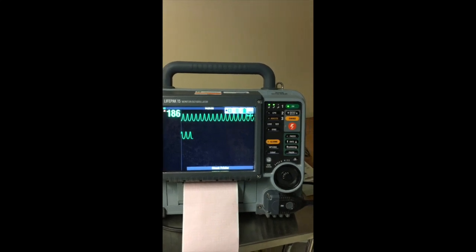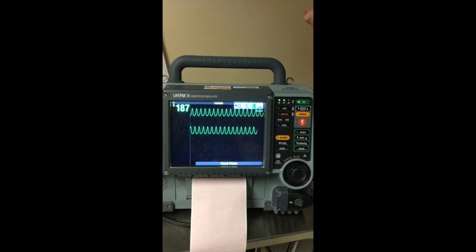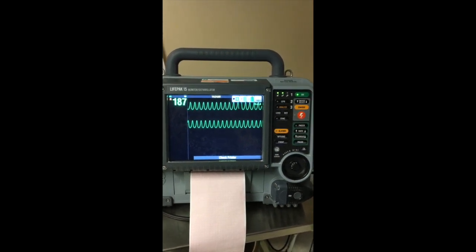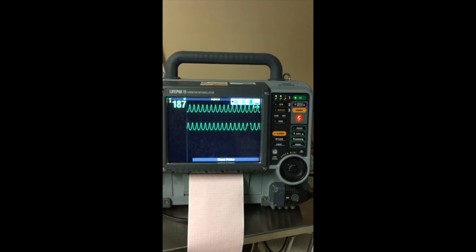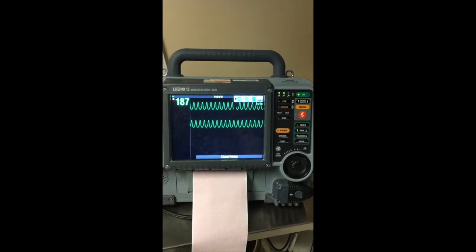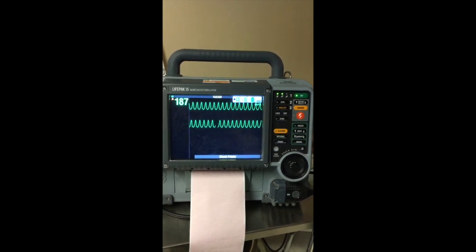For peds, you would have to take the book out. It's on the top of the code card, it will say how many. Charge and shock it. Okay. So those are the main functions of going too slow, going too fast, and then the 2 shockable rhythms. Okay. Thank you. Good.